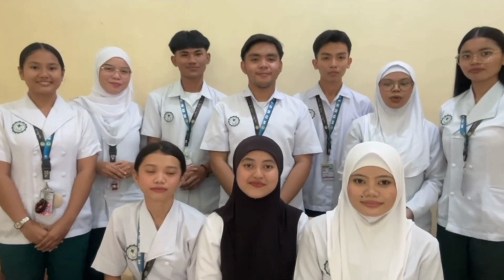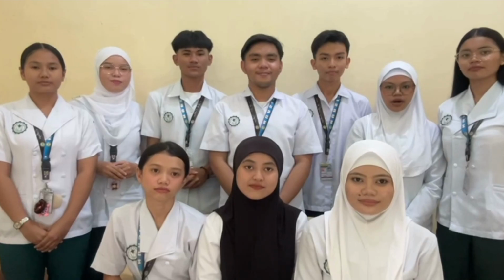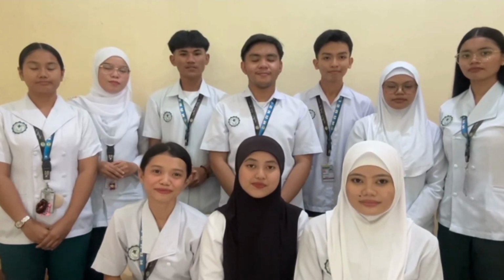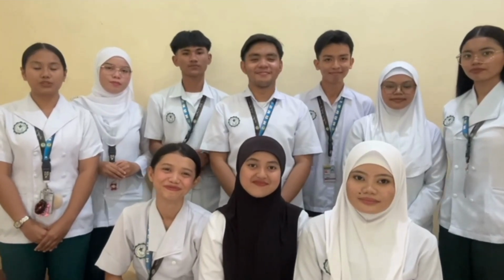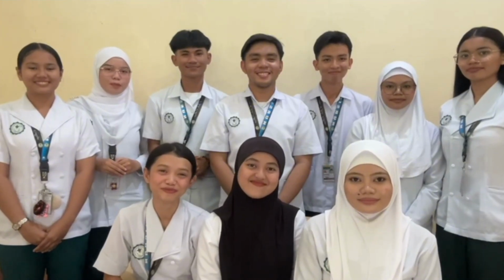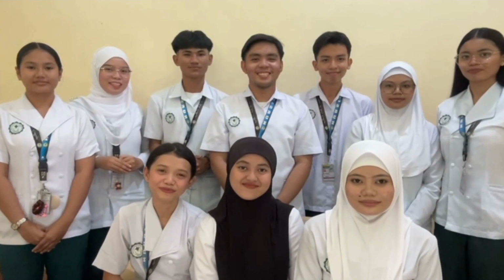In this video, we will be talking about measuring the blood pressure. We have 3 objectives, which are: First, we will tell you about the purposes. Second, discuss step-by-step procedures, with an actual demonstration of measuring the blood pressure of a client. And lastly, discuss the misconception about measuring the blood pressure. Kindly finish our video for better understanding of our topic.